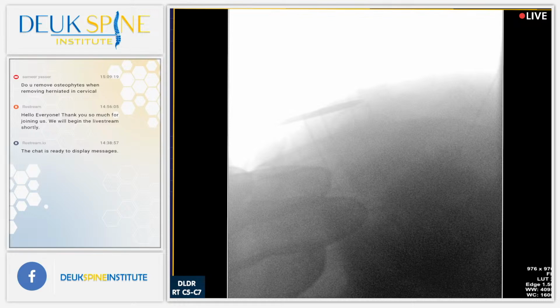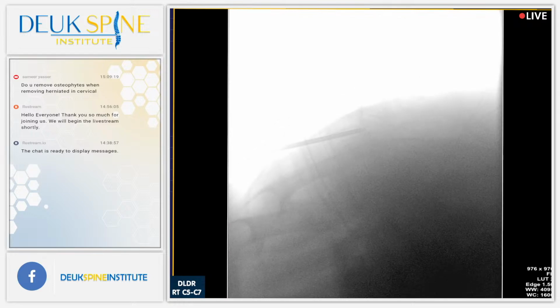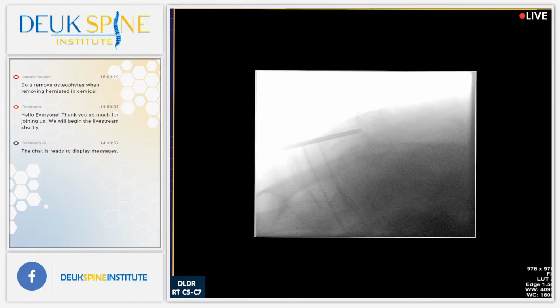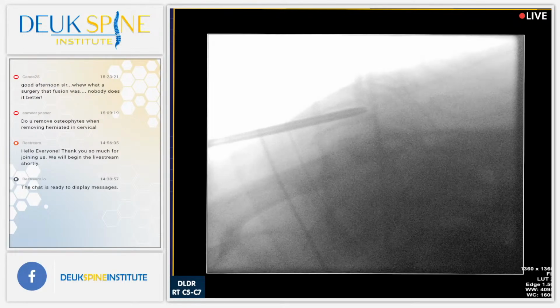All right, that's our picture there. See if you can clean that up any, Jordan. If I could just see the disc space below, that would be perfect. Almost there. I think we're pretty close. Any way to mag it in? Maybe zoom it in? Maybe bring the emitter closer? Yep. And shot. That's pretty good. I think I can work with that.